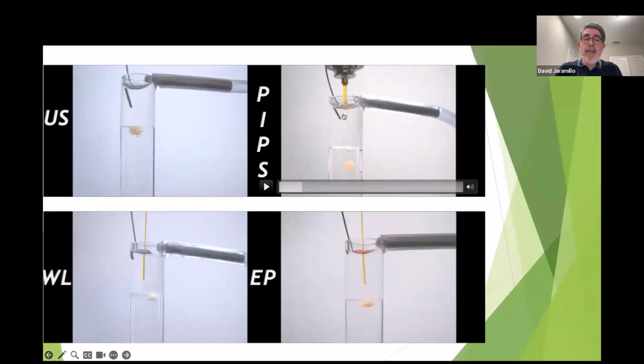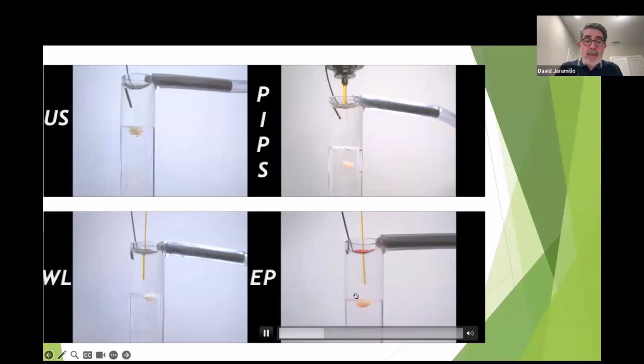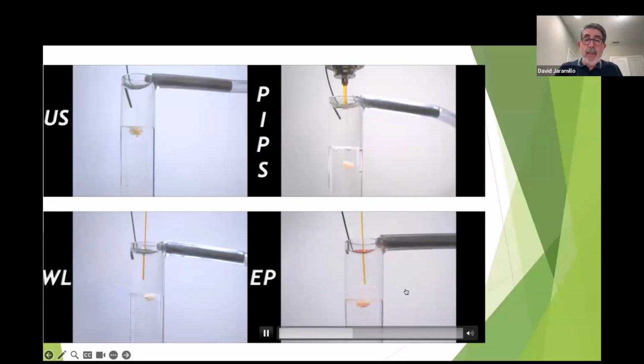This is erbium YAG laser. The technique of PIPS is to leave this tip in the pulp chamber. We don't go inside the root canal, and look at the effect that it has. It's really being absorbed in the solution. Okay, the laser is really being absorbed in the solution. While this is WaterLase, 4 watts, and this is Edge Pro, 2 watts, and we can barely see activity here. So that's why I was telling you that there is a 300% difference in the absorption.